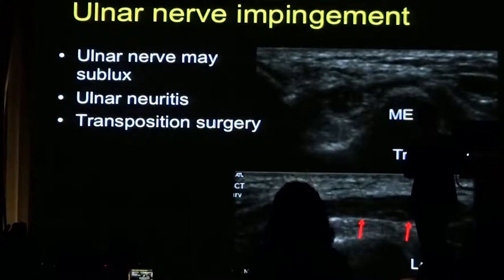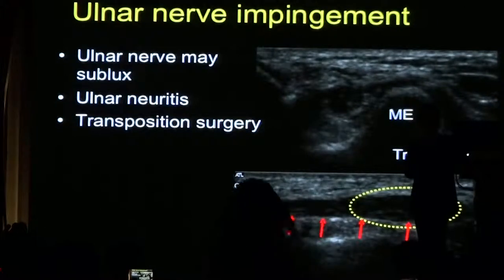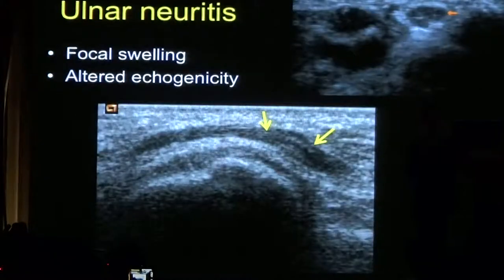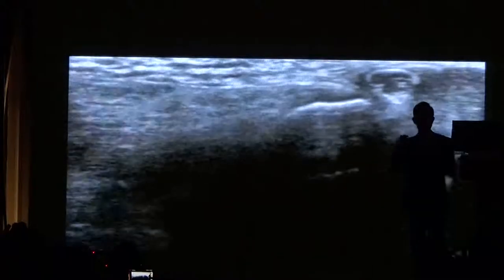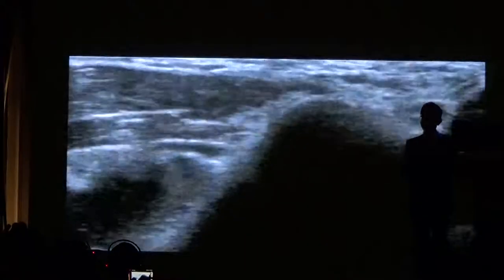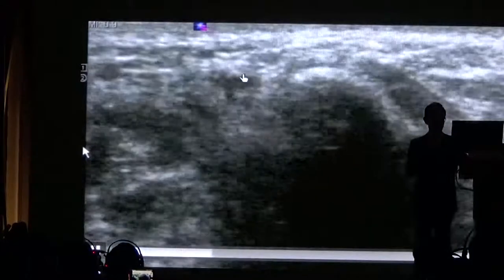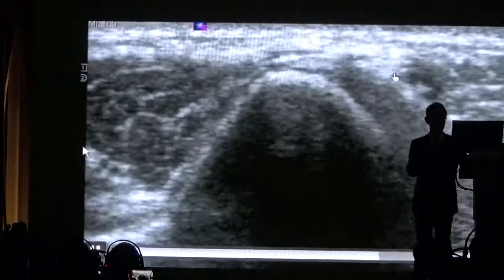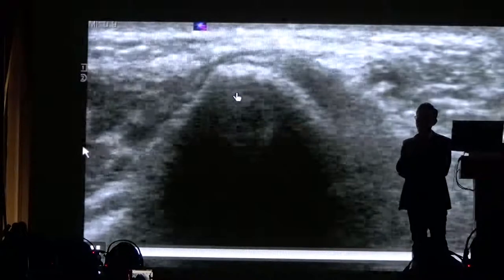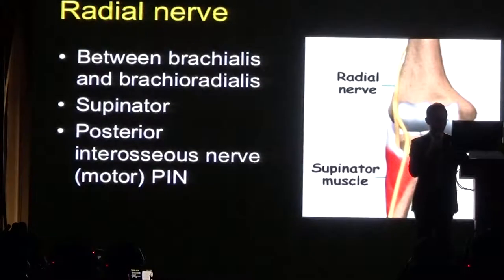That represents an ulnar nerve affected by ulnar neuritis. In this patient, you can see that as the patient flexes their arm, the nerve is wanting to sublux. Ulnar nerve subluxation may be seen in up to 10 or 15% of normal people. The patient may be able to reproduce this for you and show you at what point it crosses over.